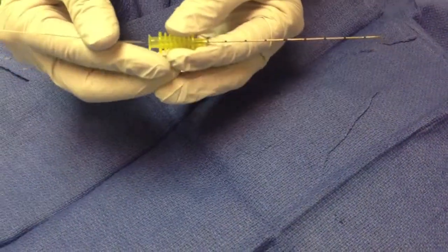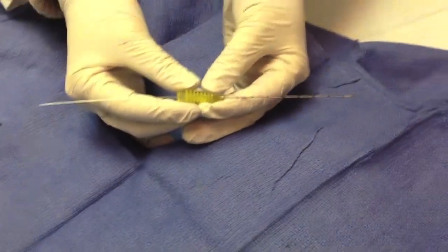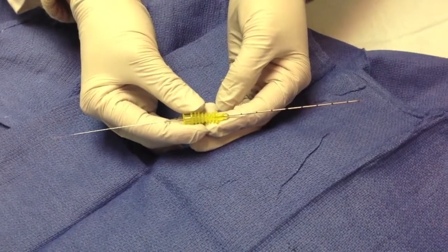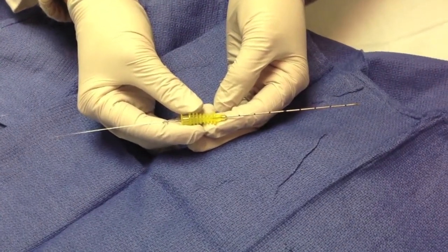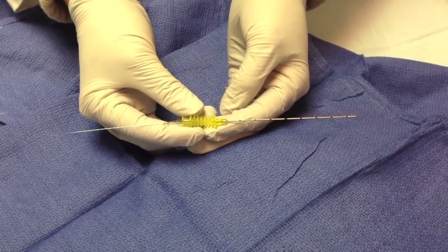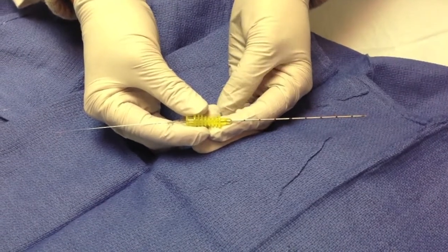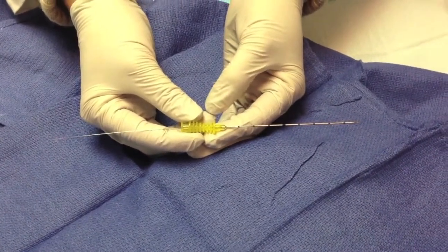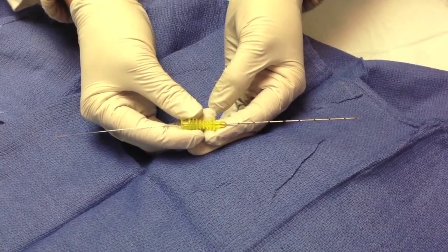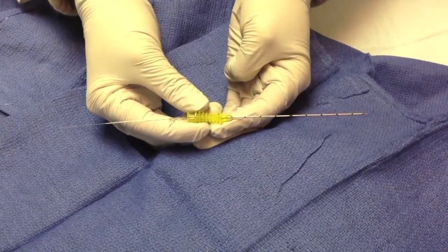The anaesthesia for these is the same, but you just don't give as much, and you usually just go proximal to the lesion when we deploy these. You're going to insert them using exactly the same techniques as you would for inserting the trocar for the core biopsy we've seen before. Same trick for visualizing the tip. You want to go through the middle of the lesion and usually 5 to 10 millimeters on the other side of the lesion to make sure it's firmly attached.